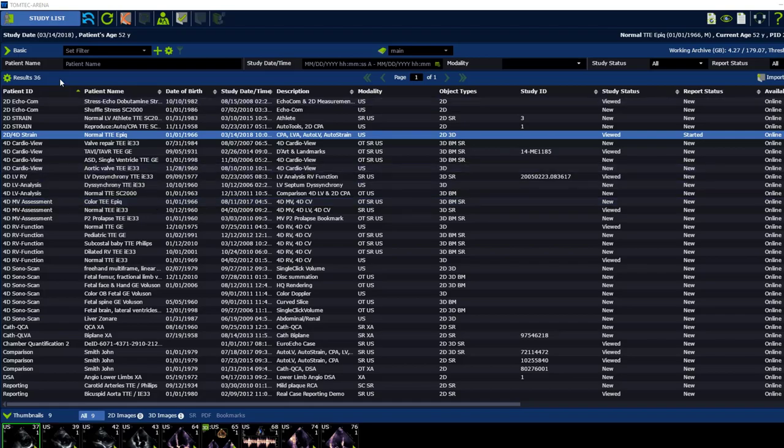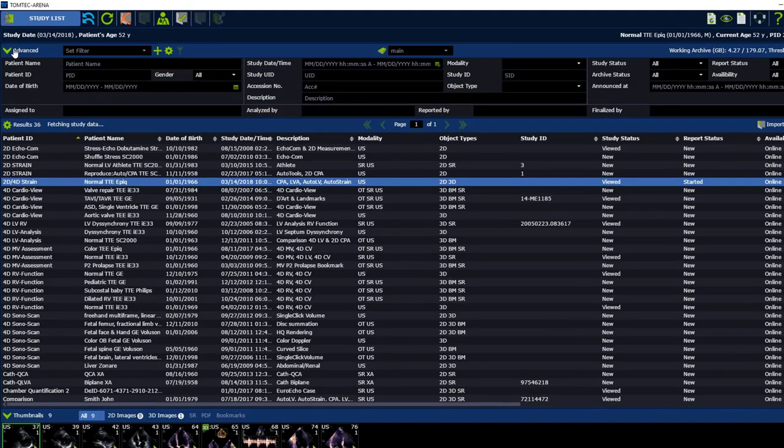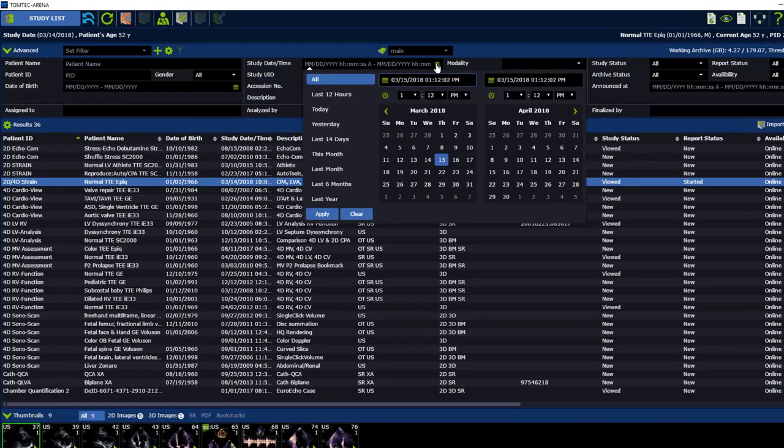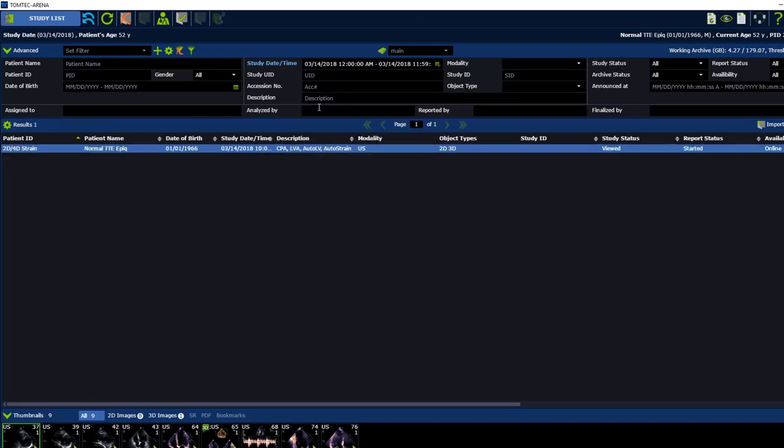Now let's focus on our patient. I want to look now for all studies from today. Therefore I am choosing in my advanced filter the study date for today and see the filtering now below.